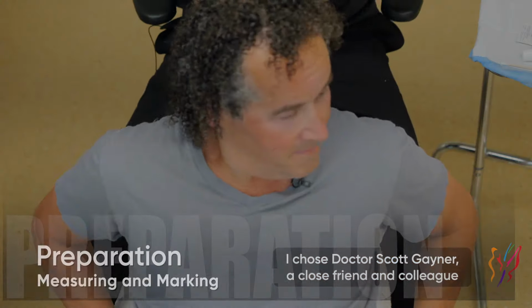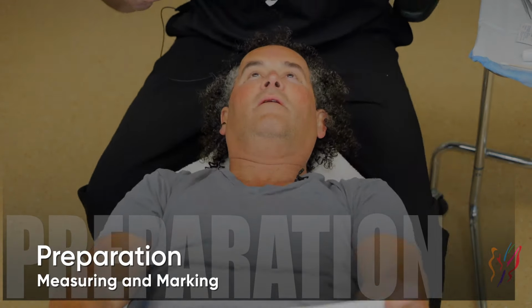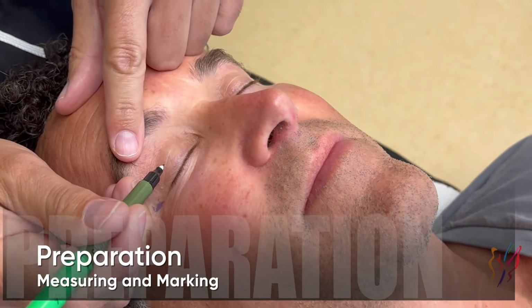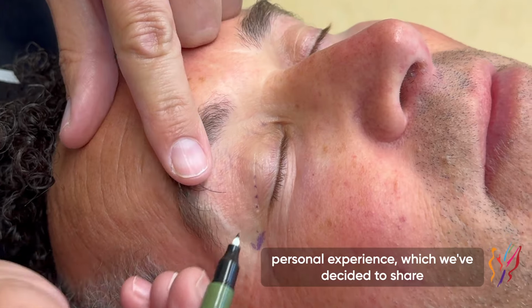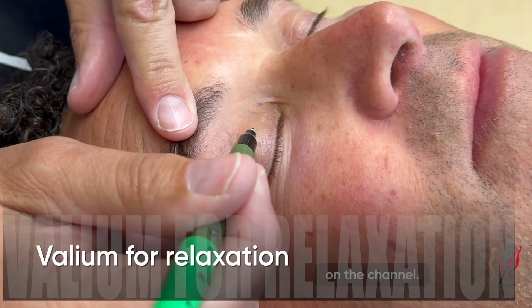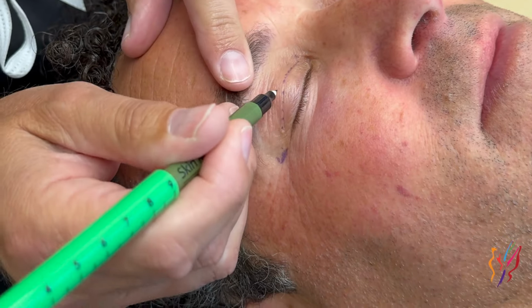I chose Dr. Scott Gayner, a close friend and colleague I trained with. Today, I want to take you through the surgery itself. While we have other videos that detail the steps of this procedure, this particular video captures my personal experience, which we've decided to share on the channel. Typically, patients are given Valium to help them relax during the procedure.